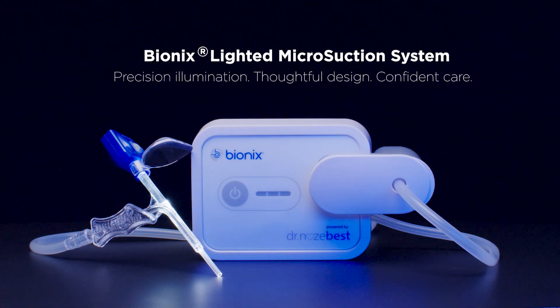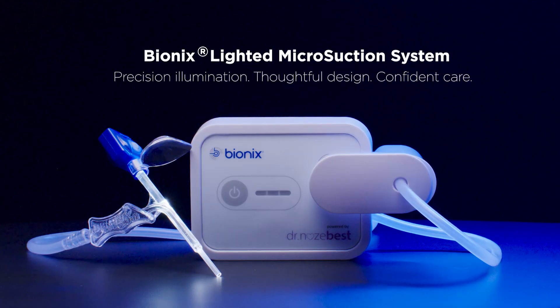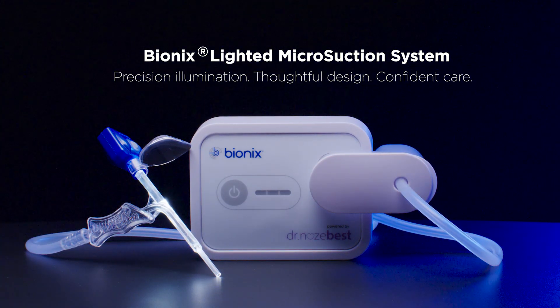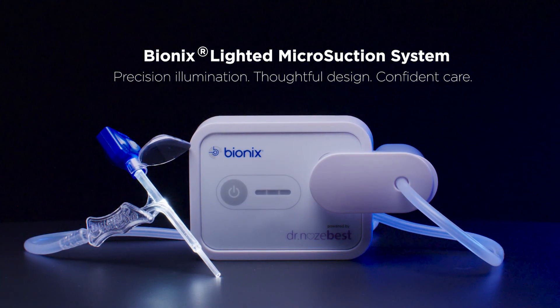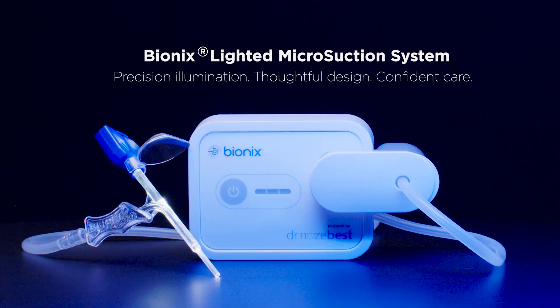The Bionics Microsuction System combines bright illumination, magnification, and a hospital-grade suction pump to support safer, more effective removal of cerumen and foreign bodies in both ears and nasal passages.